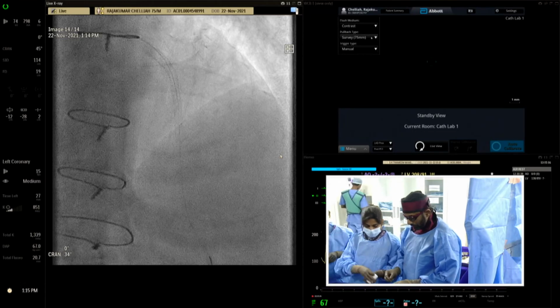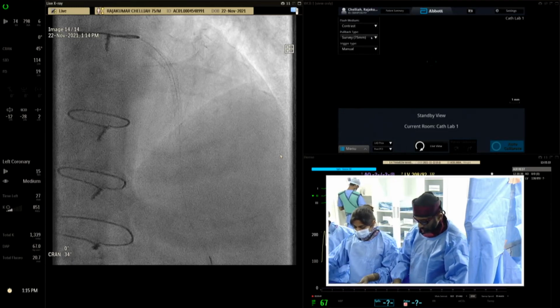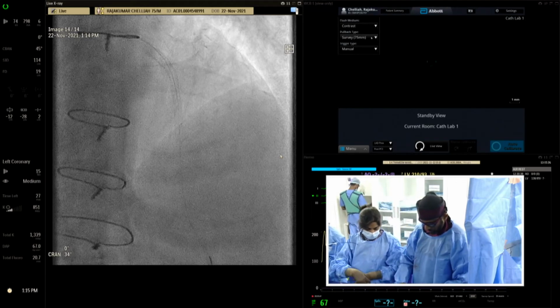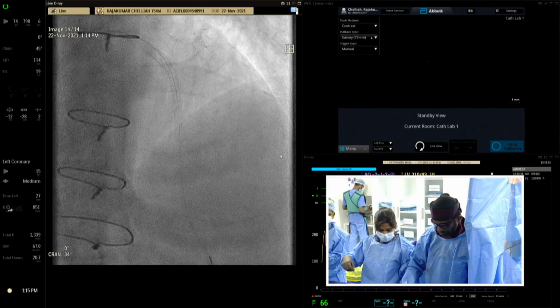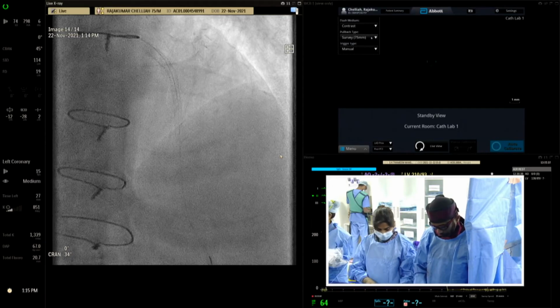So we think we have done a 4 millimeter post dilatation, and we think we will be able to get a good result with this. We will confirm that by an OCT before we finish our case. If there is any discrepancy, or anything we are not happy with on the OCT, we may go back with further ballooning of the LAD.